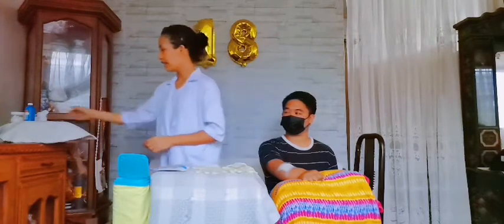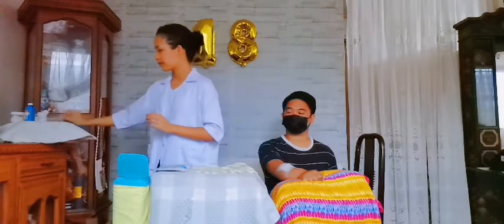And then the next procedure for the wound care is planning. So we assemble the equipment. This is to save time and effort. Our equipment would be, first, clean gloves or disposable gloves. Then next are the sterile gloves for the actual wound dressing. And then gauze pad, 2x2 gauze pad.